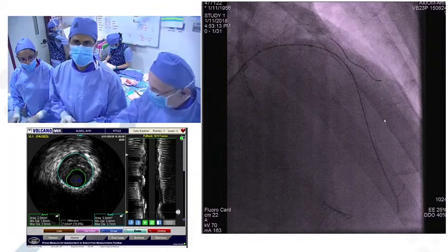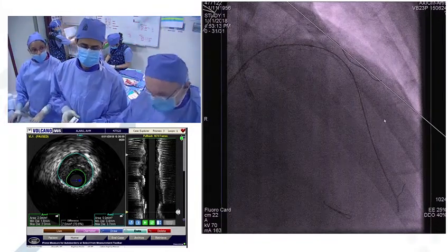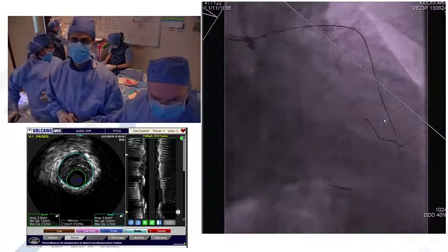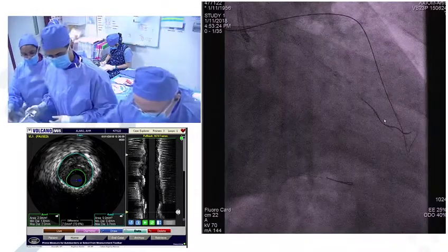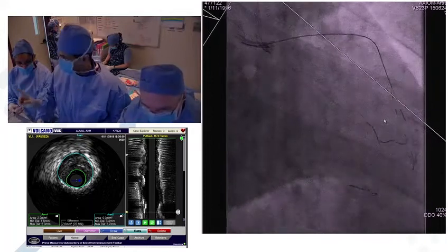Go up. And now go to cranio-caudal. 12, 14. Show me. So, okay. And anyway, IVUS is on the table, well, for... Highlights.